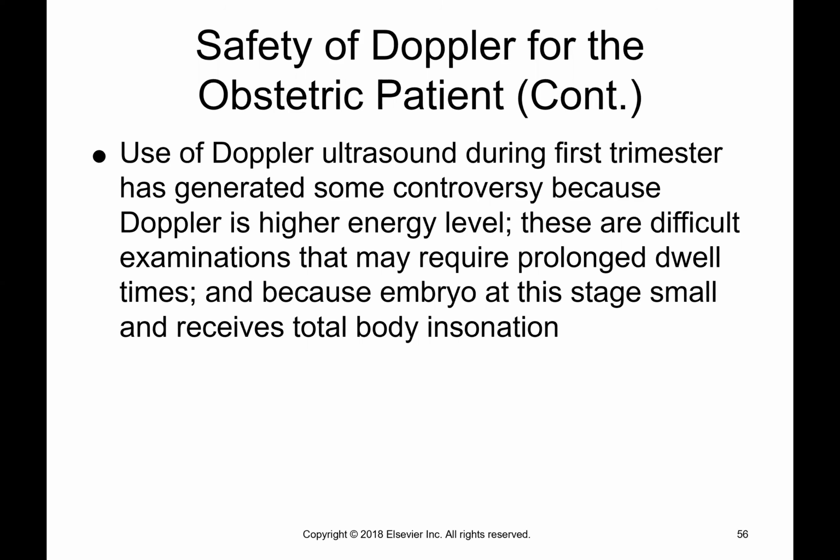And the Doppler, to hear the heartbeat, is such a high energy level for this little heart that's just started beating that I do not teach my students that we should do pulse wave Doppler on a little heart in the first trimester. Not that anything has been known, but it's such a tiny developing baby that it's just not worth putting extra energy from the pulse wave into the little baby that's just trying to get that heart to develop.